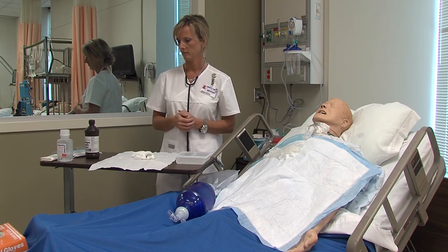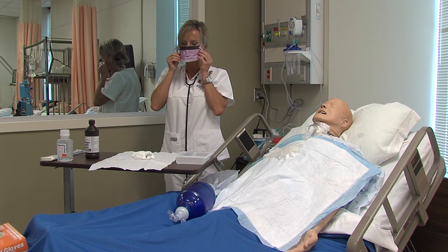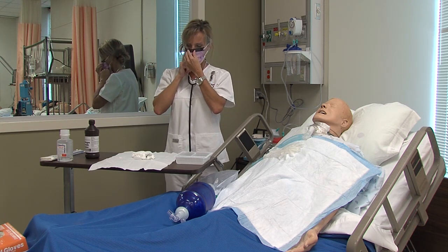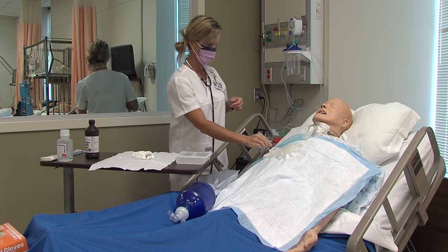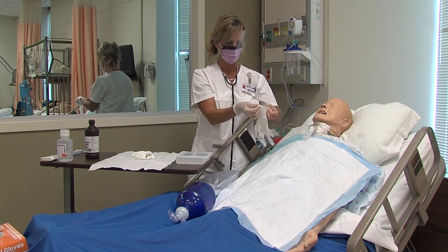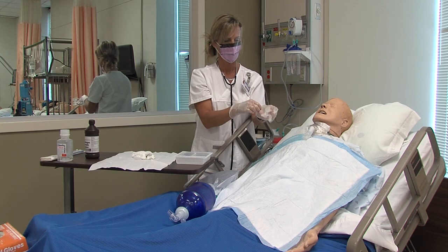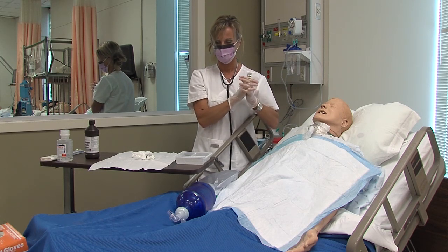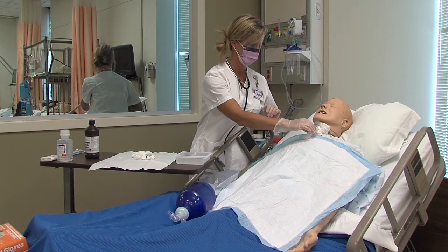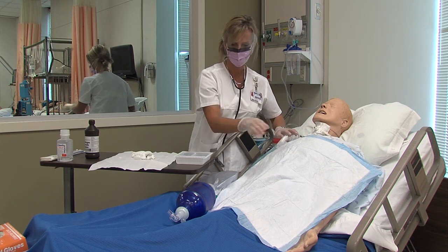Put on your mask and eyewear. Put on your clean gloves. Use the Ambu bag to hyper-oxygenate your client for one to three minutes, just like you did in the trach suctioning procedure.